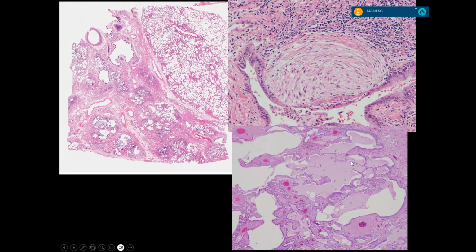Alveolar space filled with hyaline, with mucin, yeah, you're good. What's going on there? Is that the pleura? Is this an open lung biopsy? This is an open lung biopsy. This stuff down here is pleura. This is very low magnification of the lung. So is this like pulmonary alveolar proteinosis? All right, that's a good thought. Let me give you a stem, okay? A little bit of a stem.